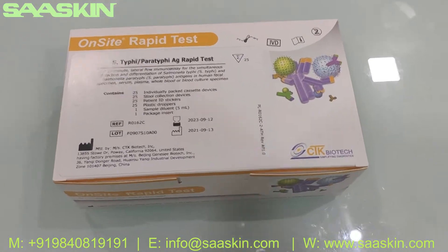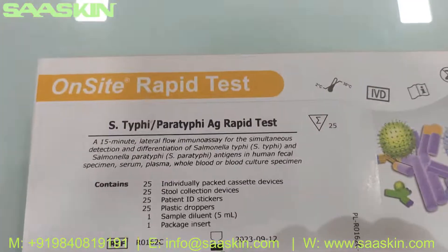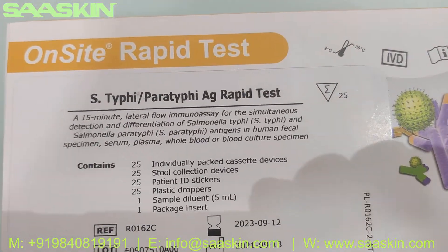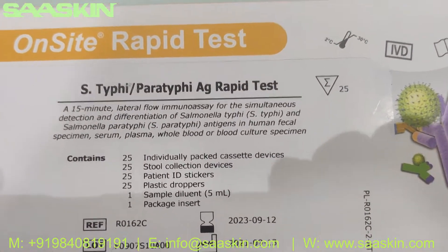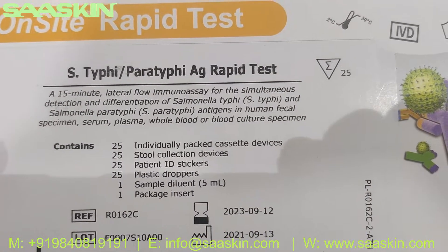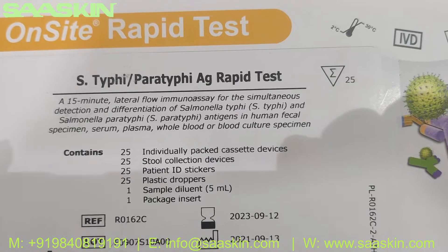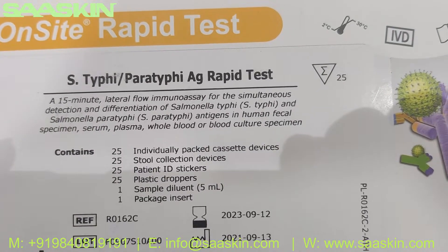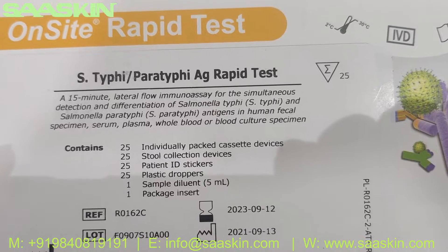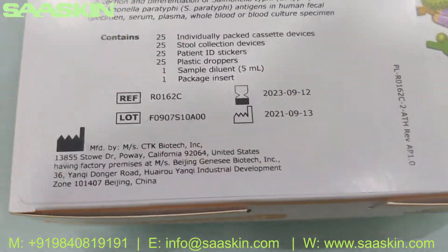Hello everybody, today we're going to see the unboxing of CTK Biotech OnSite S-typhi/Paratyphi antigen rapid test kit. This is basically used for the detection of S-typhi and Paratyphi antigens in human fecal specimen, serum, plasma, whole blood, or blood culture specimen. This is how the box looks like.